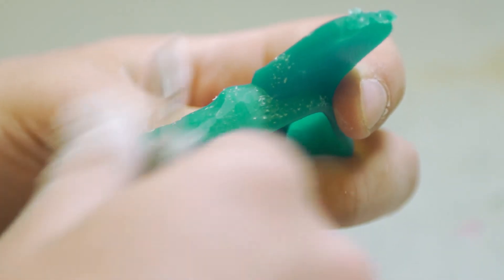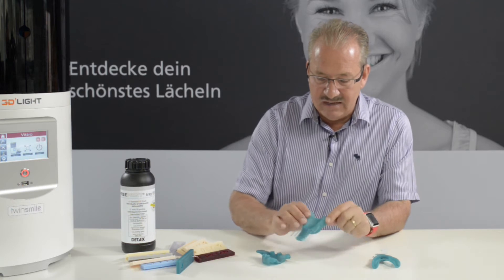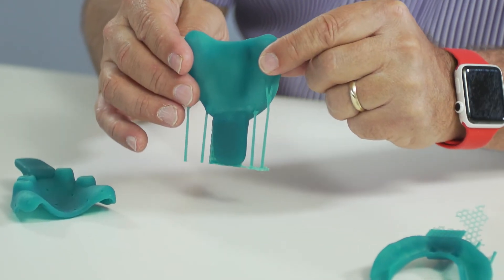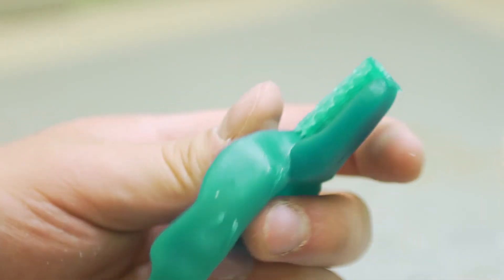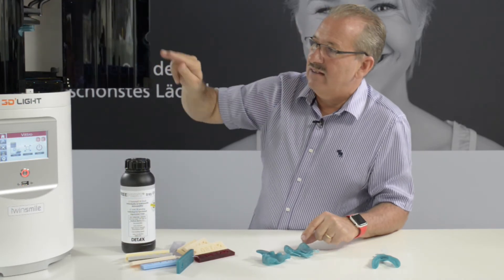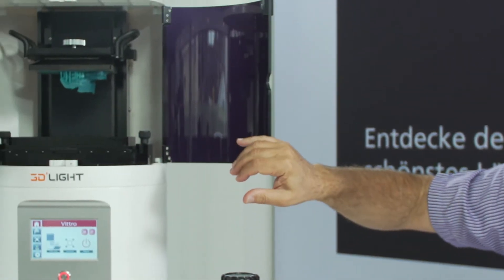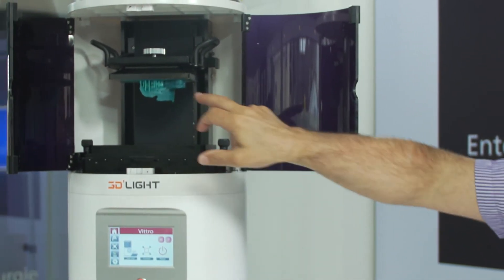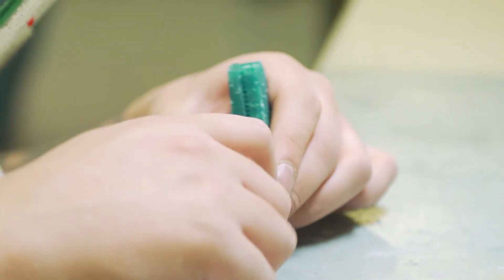There are two ways to print these trays. One way is to print it in a standing fashion like you see here — the advantage is that you only have a few supports to remove and the tray is finished. If you print it the flat way like you see here in the printer, this allows us to print the trays in about 10 to 15 minutes. You can print them very fast, but then manually you have to remove the supports, which really doesn't take much time either.